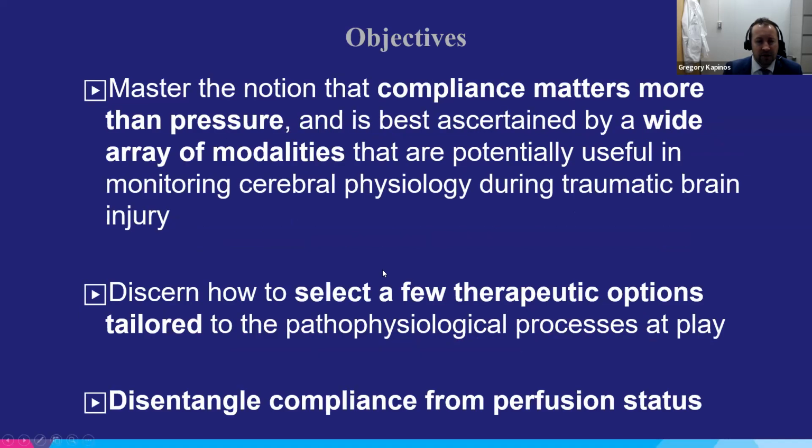The objectives of this talk would be, I hope the audience will gain some knowledge, or at least a reflection on what they conceived about ICP and TCDs, and eventually develop a better notion that compliance matters more than the pressure inside the skull, and that there are diverse modalities that can assess that. And of course, conventionally, we rely on an EVD to tell us what is the ICP, but there are other modalities that can give you even more information.